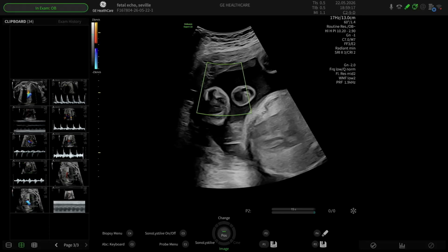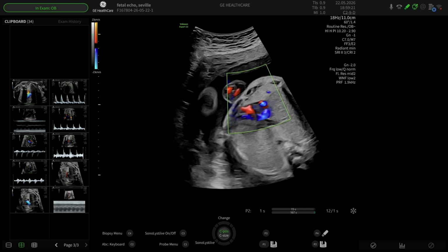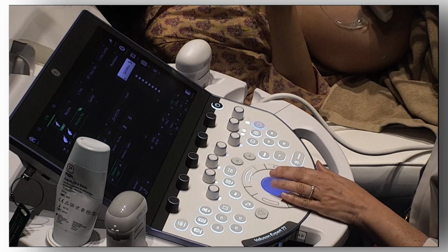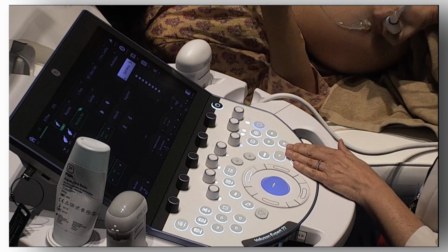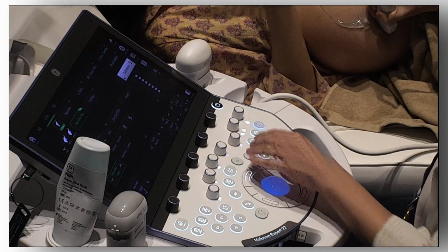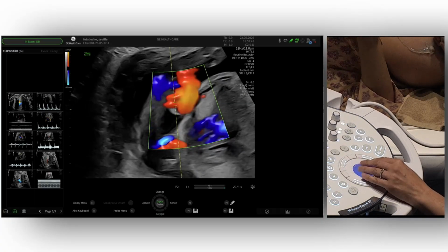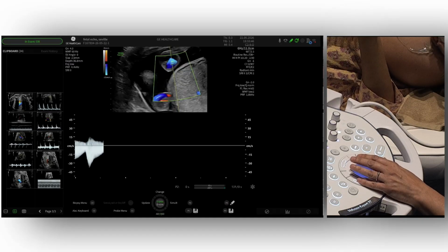So to start with, we can just go to the umbilical artery, as also Julien has explained. Well, this baby moves a lot, but let's hope that we will manage. Okay, let's try to find another loop that doesn't move that much. We are going to look at the umbilical artery because it will reflect for us the ventricular contraction, and will tell us what the ventricle is doing.